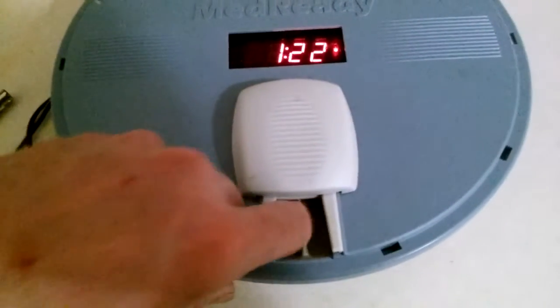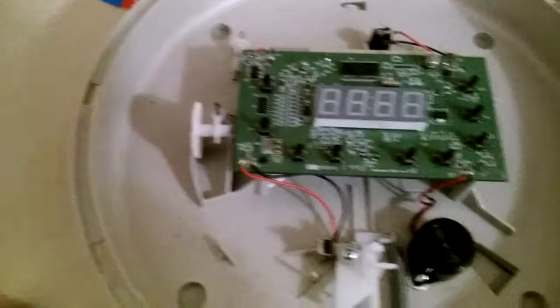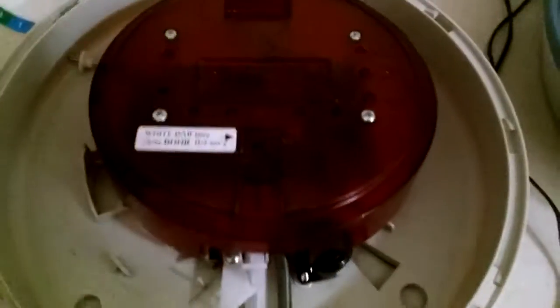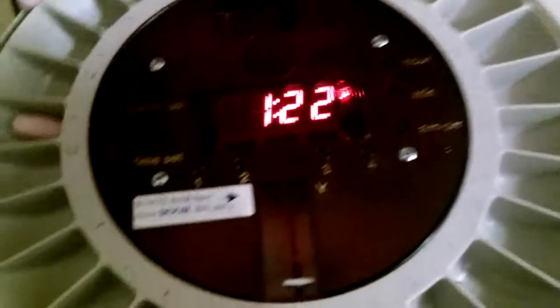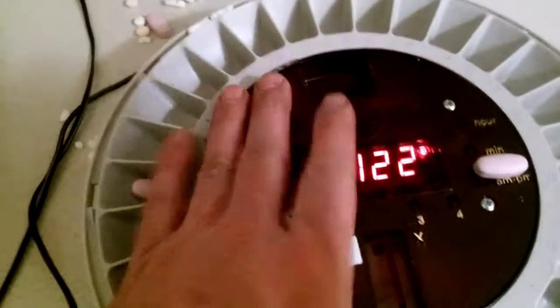The only issue is if a person sticks their hand in trying to get more doses. Here's one taken apart - there are the gears, only three to four bucks for the gears. They break but they come out very easy. This cover comes off real easy, you can order extra plates and order a cover for the top. The battery is hiding under here - it's just a cordless phone battery, but they do sell them on their site.